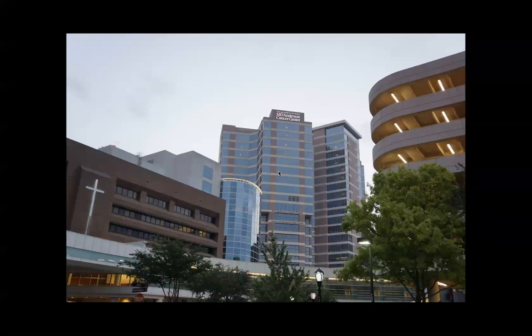So the answer is no, I will not refer this patient to the surgeon. I would cut it myself. Even if you have to cut using an ESD, it wouldn't make any difference if you inject well and cut above the hemorrhoidal plexus. The plexus is very clear cut. It's at the bottom, running over the muscularis propria. Maybe I will try to find some movies from my prior cases to show you where the plexus is and how to avoid it during a resection.